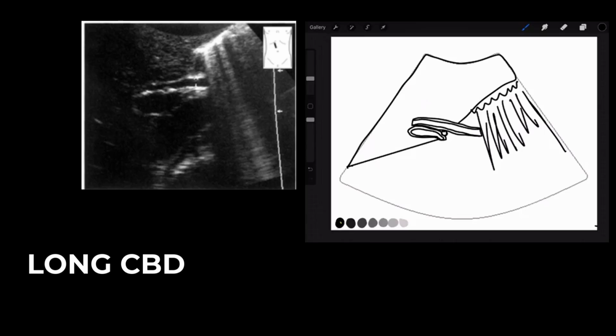In this image, we are focusing on the common bile duct, so we are looking for the area outside of the liver, following that invisible porta hepatis line. Remembering that bowel can sometimes be in our way, we want to use windows that allow us to see as much as possible. The portal vein will always be posterior to the common bile duct. The hepatic artery is typically in cross section or short segment of it. And again, we can see the common hepatic duct and the common bile duct.